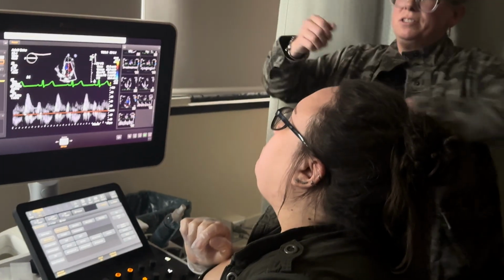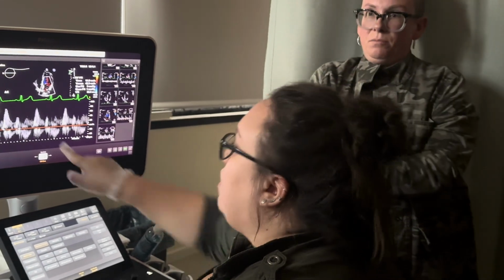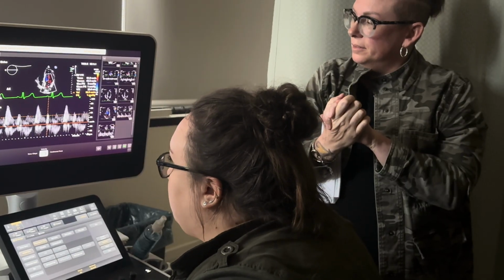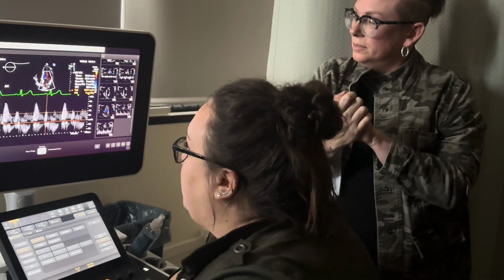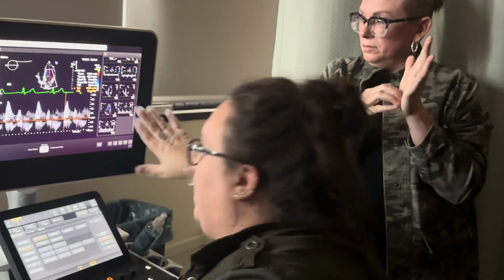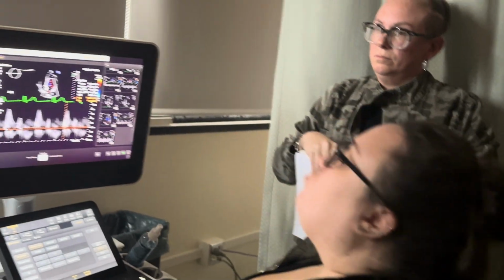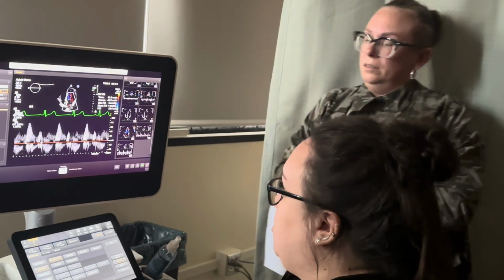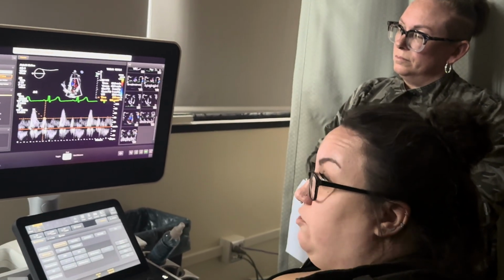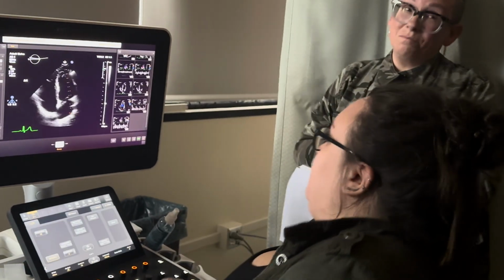So what we talk about is we don't want to do that one little guy that's going a little bit faster than the rest of the medians. Like with this one, I would measure it to right here and not do that little extra blip because that is an outlier. I mean, that's me being super picky, but yes, in that situation, you ignore those extra ones, unless it's really high amplitude. Because sometimes your mitral valve, instead of having a nice M like this, does more like this action. That means the valve is busted.